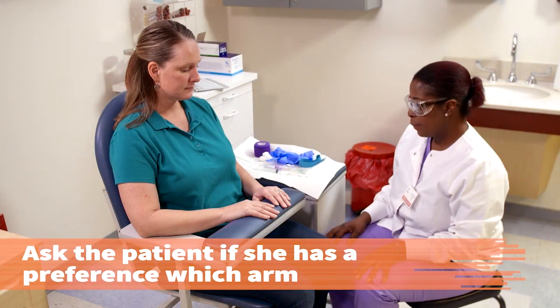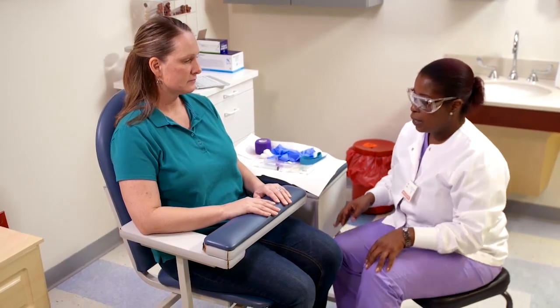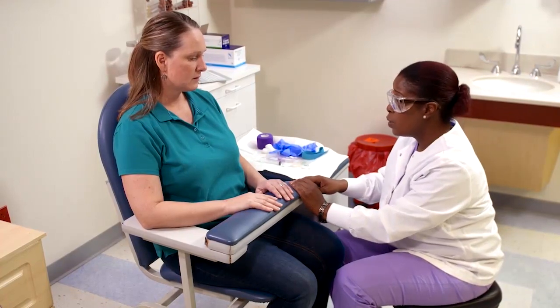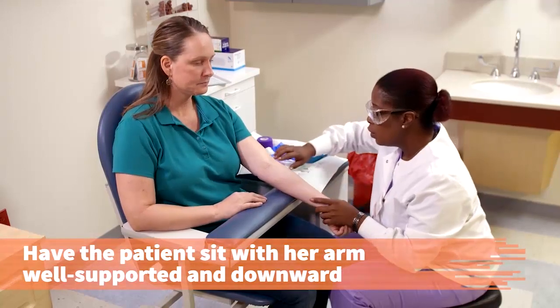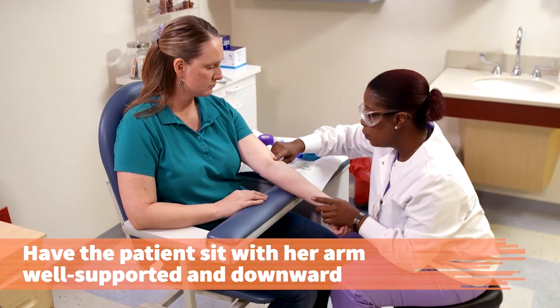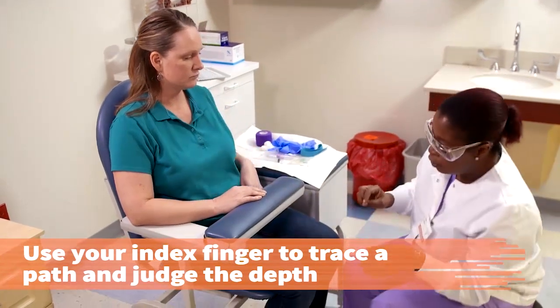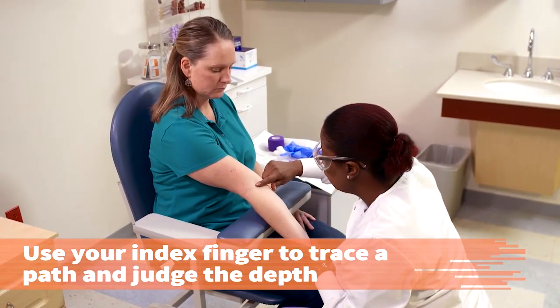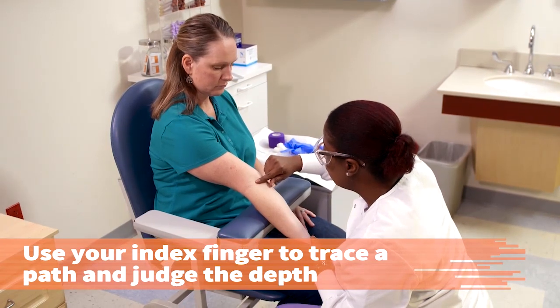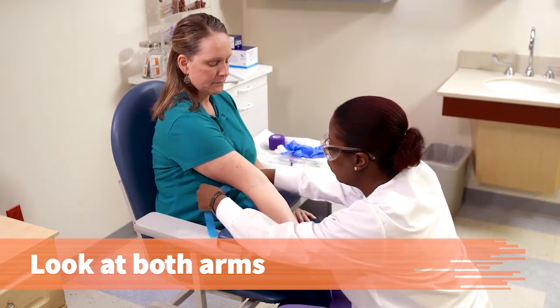If drawing from the antecubital region using a syringe, ask the patient if she has a preference which arm is used for the venipuncture. Have the patient sit with her arm well supported in a slightly downward position. Use your index finger to trace the path of the vein and judge its depth. The veins most often used are the median cubital or cephalic veins, which lie in the middle of the elbow. You may need to look at both arms to find the vein that will give you the greatest chance of success.